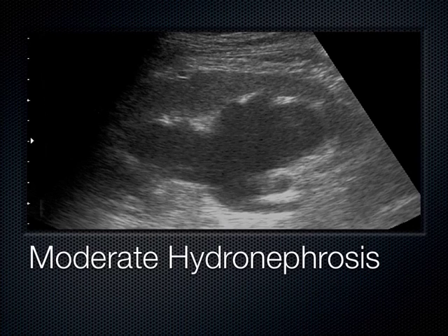This is what happens when we get a lot of hydronephrosis backing up in the kidney. Our cortex is starting to go away, and all those finger-like projections are now coalescing to one large hypo or anechoic area here seen in the pelvis of the kidney, and that's more like moderate hydronephrosis. When all those fingers come together, we can still make out the cortex though. See out here we can still see cortex? If all I saw was a big black center where the kidney should be and there's no cortex left, it's very, very rare, but that would be severe hydronephrosis. The fact that I can still make out cortex tells me this is probably moderate.